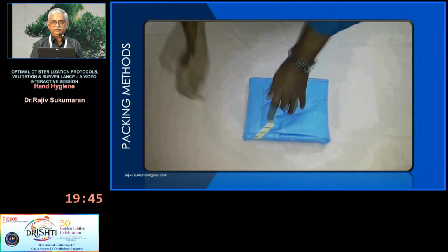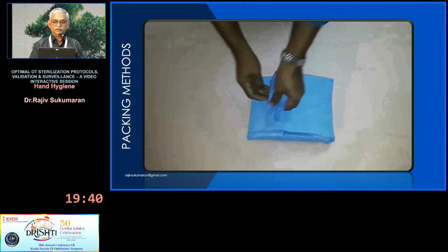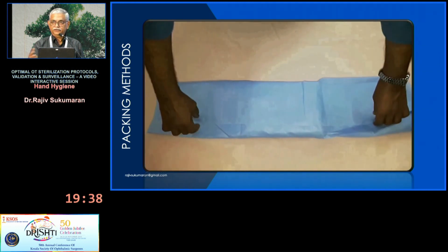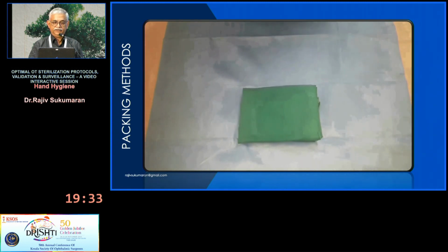It is meant for the theatre staff to start the theatre initially. Just remove it, put it on the table, on the tray, and then open and start the theatre. That's the way of doing it.